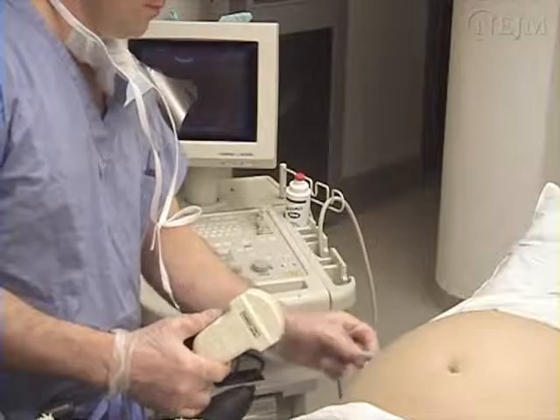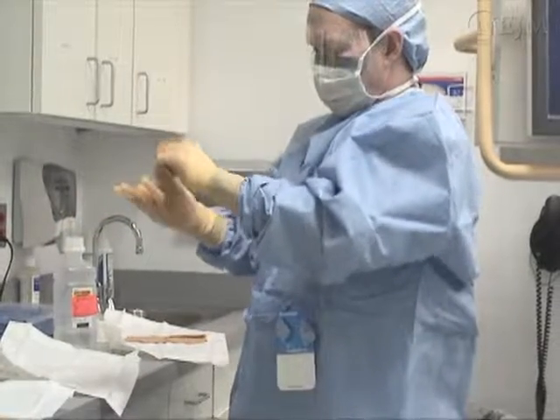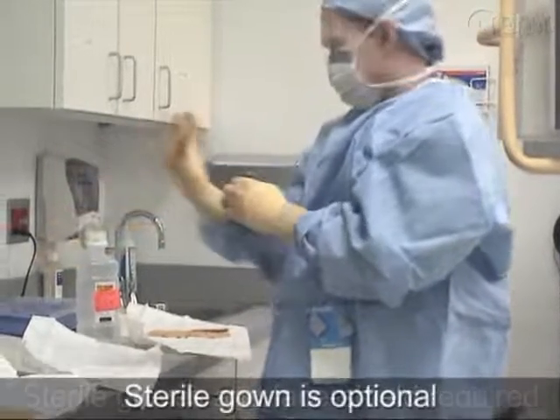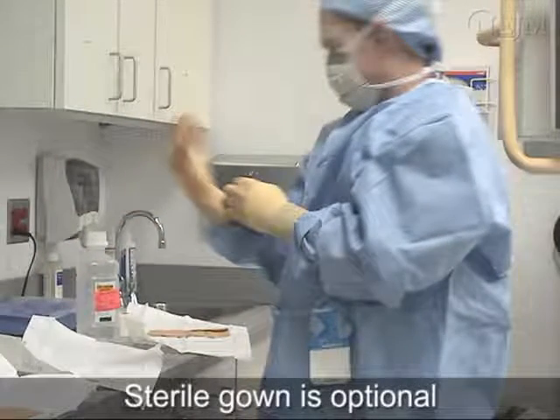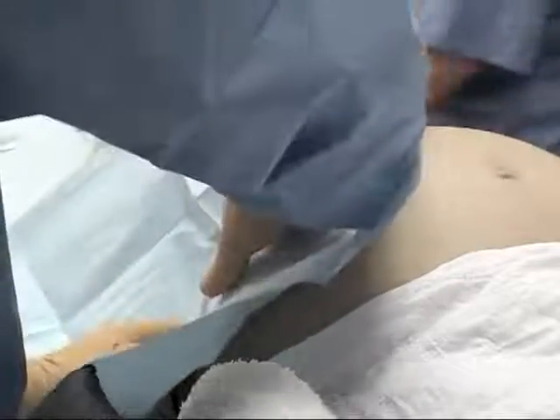Mark the site of needle insertion with a skin marking pen. Paracentesis is a sterile procedure. Sterile gloves and a face shield are required. The use of a sterile gown is optional. Prepare the site with an antiseptic solution and then apply a sterile drape.